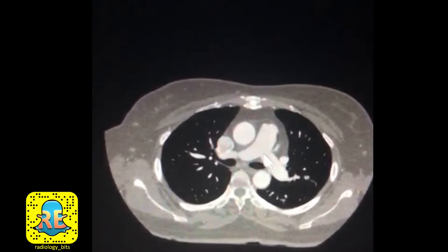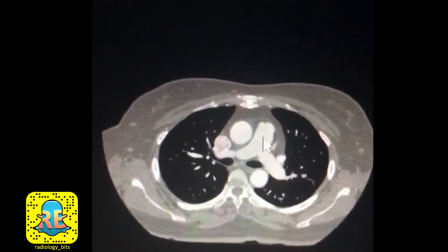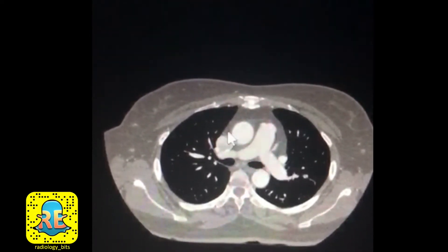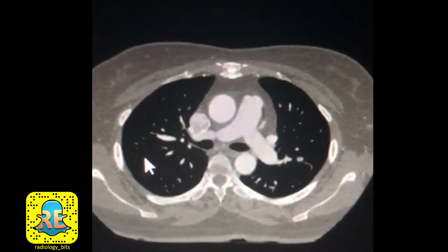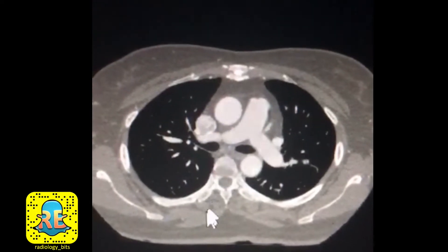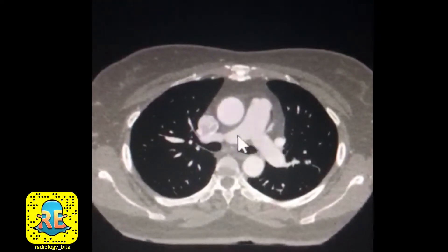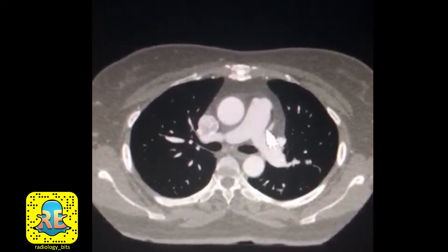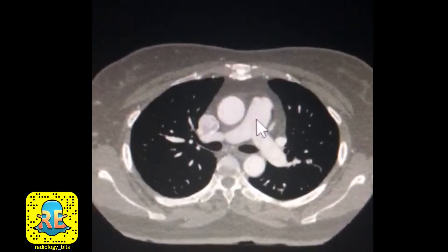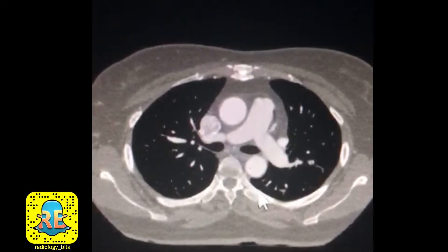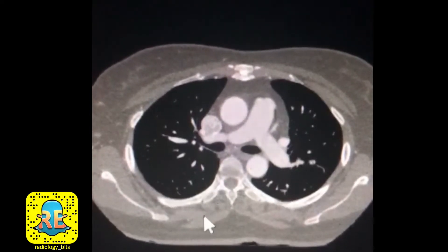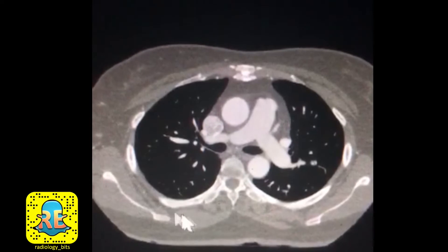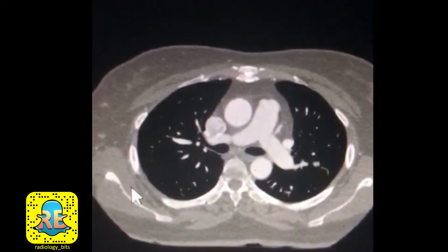In particular those that are vascular. Here is your pulmonary artery, here is your ascending aorta, and that's your descending aorta. The different colors on the CT scan are called densities. We started with the very bright density within the vessels because we gave intravenous contrast. Another example of a density is that of the very white bones, such as you see here — this is a rib. Soft tissues such as the muscles and the chest wall have a different grayish color.